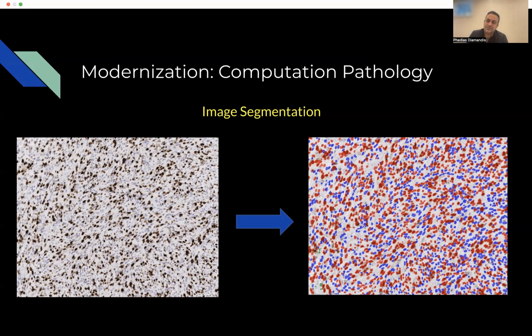You can eyeball it. Sometimes your estimate may be off, or counting them is a very laborious process, right? So image segmentation tools will not only identify, but can bin and count the positive and negative events in a specific slide and allow you to do this automatically. So this is really cool because now we can use these as biomarkers to see if the exact percentage is a prognostic marker of outcome or disease response.